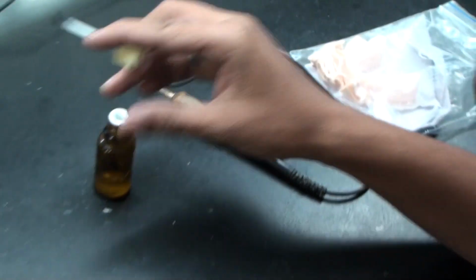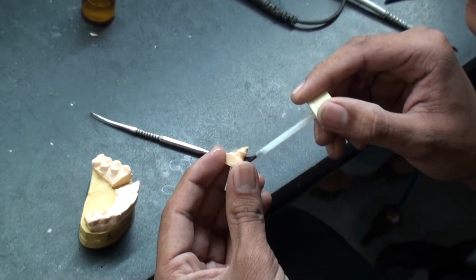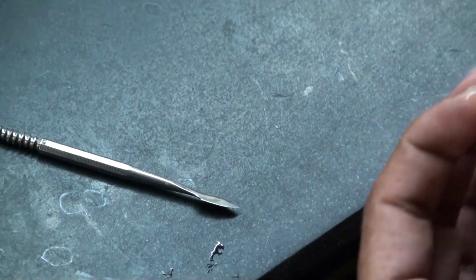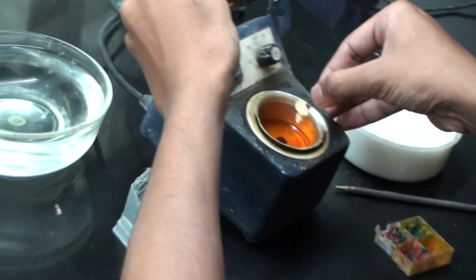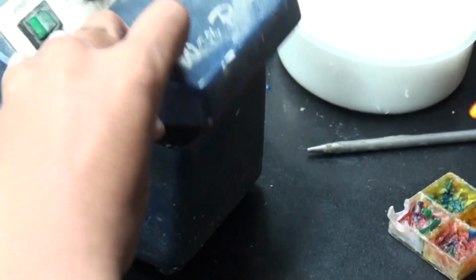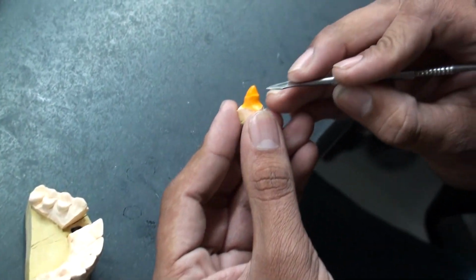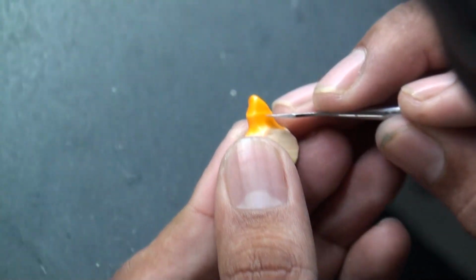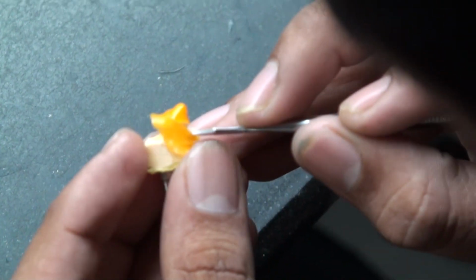And the other one, he's going to take a little brush. That is the separator, I think so, yeah. And then he dips it into this pot of wax. Now what this does is it allows an even coat of wax onto the prep. It hardens quite rapidly, and he's going to pick off the excess that's gone beyond the finishing line of the prep. Trim it all away. There we go.